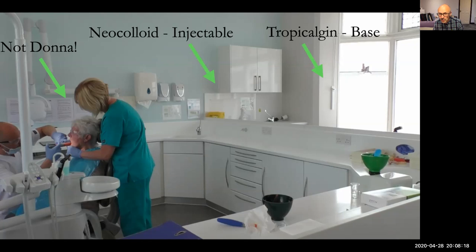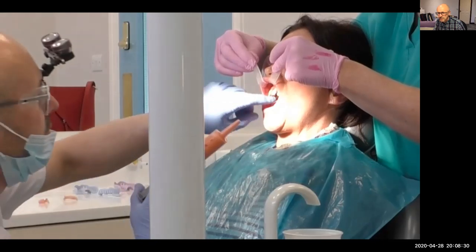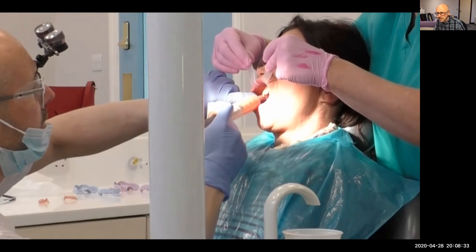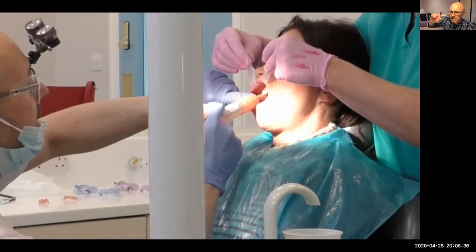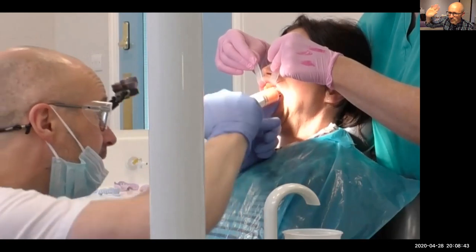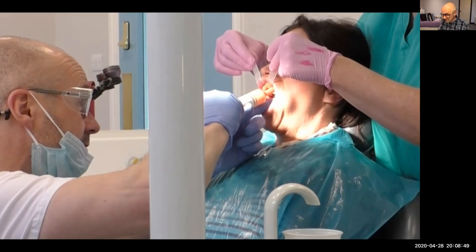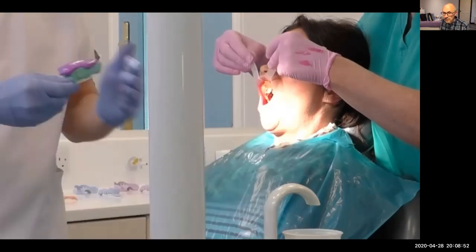I want to take you now to Donna here. So here she is. I'm going to do the upper impression, and I'm thinking about the sulcus. I want to get this injectable material right around the back of the tuberosity. You can see I'm going right the way round, up into the sulcus, all the way round to that back tooth, right into the tuberosity there. And I'm talking to Donna the whole time. Claire's got these lovely little lip retractors in place. These are photographic retractors that we've just cut down, and they're beautiful for lifting the lip out of the way.